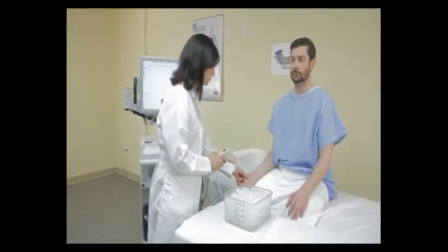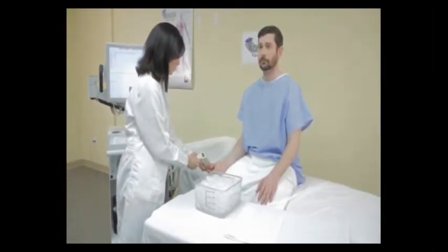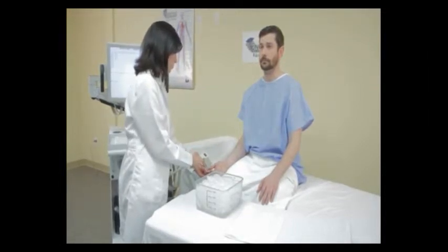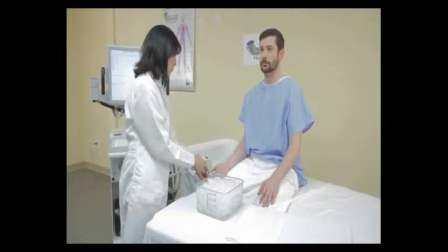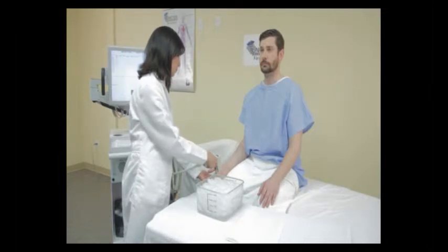Next, take the patient's hand and place the sensor about half an inch away from the digit. Press the button, hold for two seconds, and then go to the next digit. Press and hold for each digit in sequence.